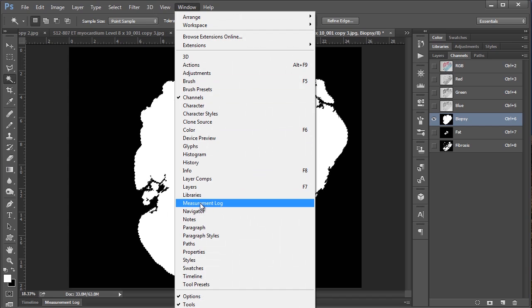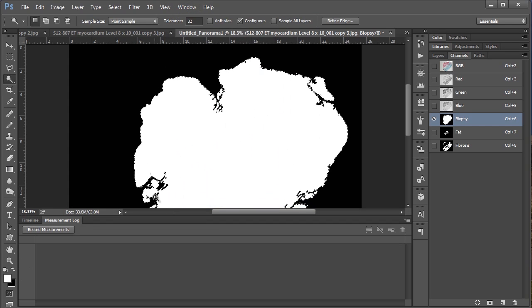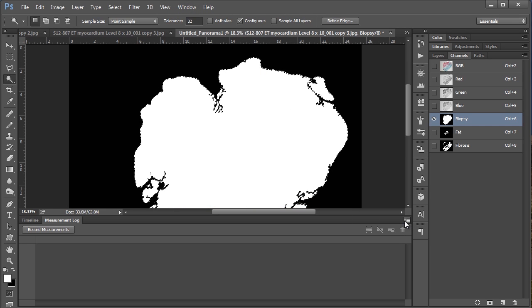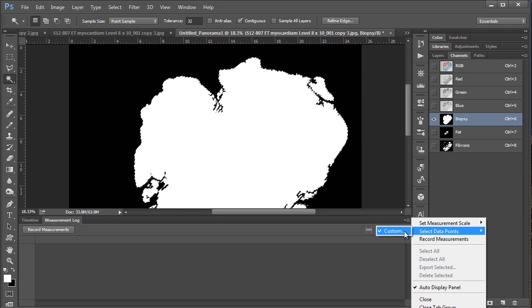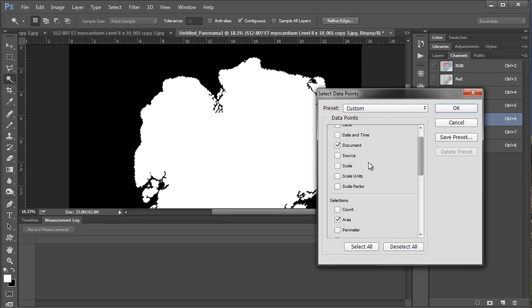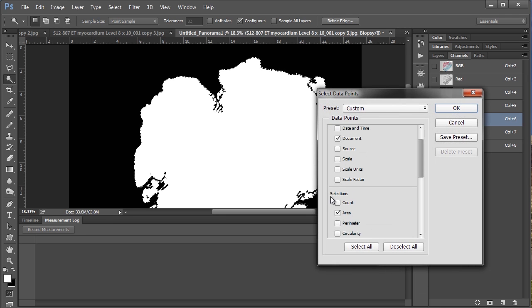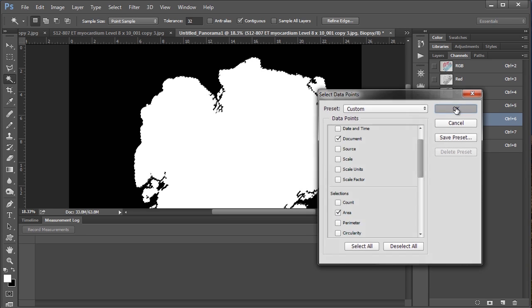And if we go to this little drop down menu here, we want to say select data points and go to custom. And this will allow us to specify that we want to measure the area of the selection. So just make sure that's checked and then hit OK.